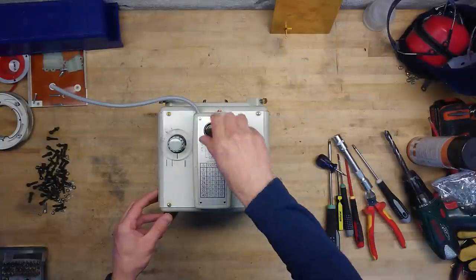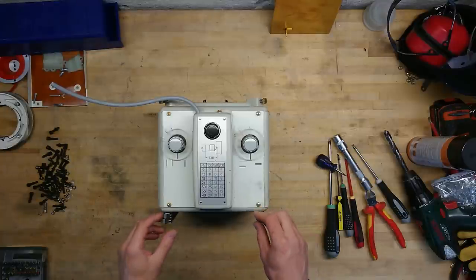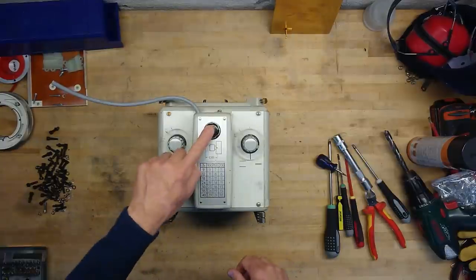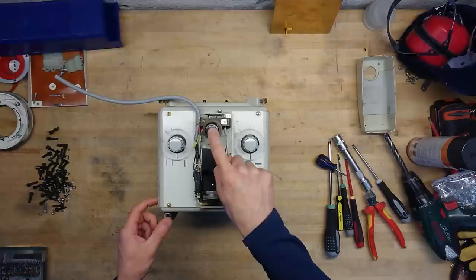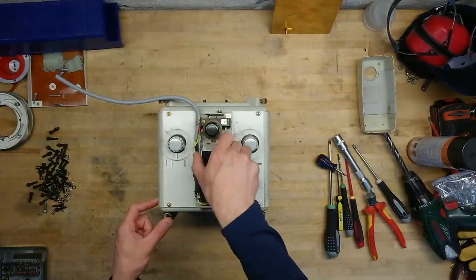It also has this very weird light timer. I'm not quite sure why there is this timer, because if I was lying underneath this and I was sick, I don't like the sound of that. But that activates a few contacts here on the inside. There's also another contact when this gets all the way over, to turn off the light again.